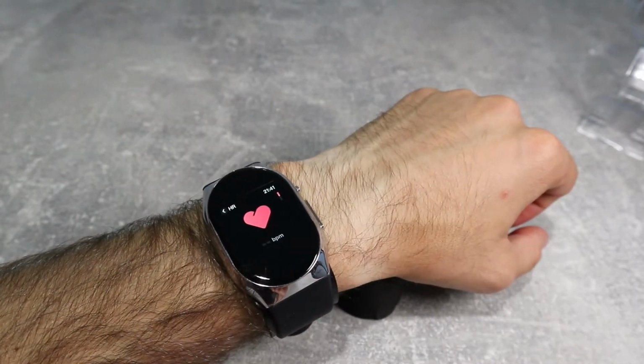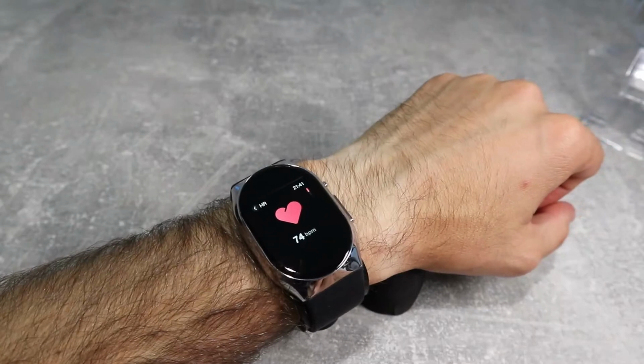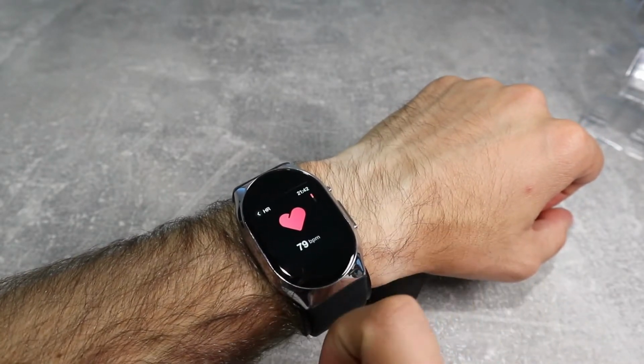Next, let's go to the heart rate monitor, which will constantly measure your heart rate and can show you your previous and average heart rate.